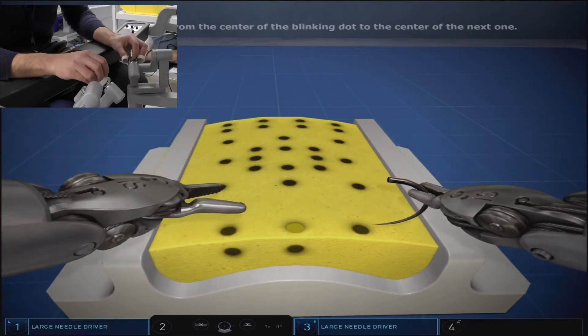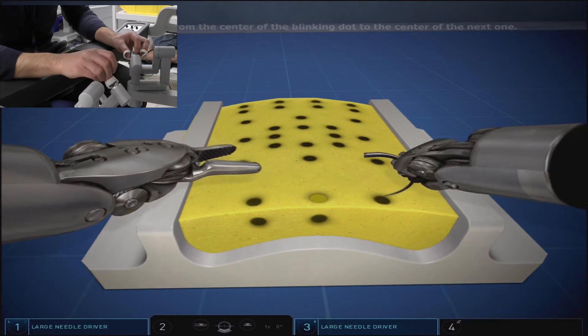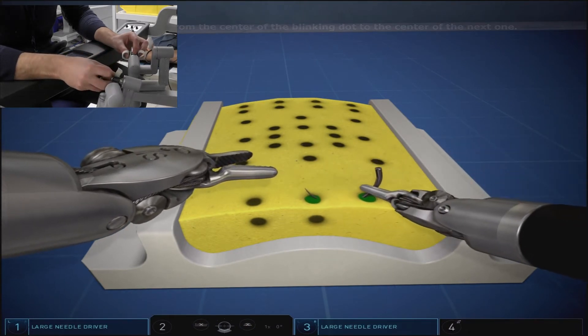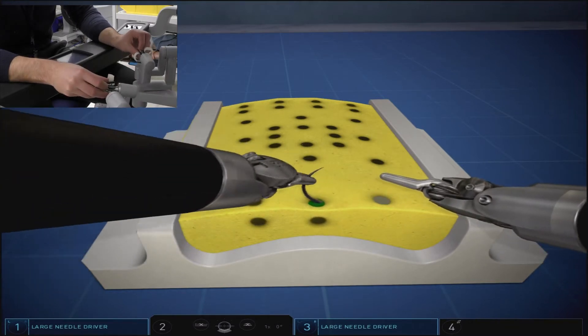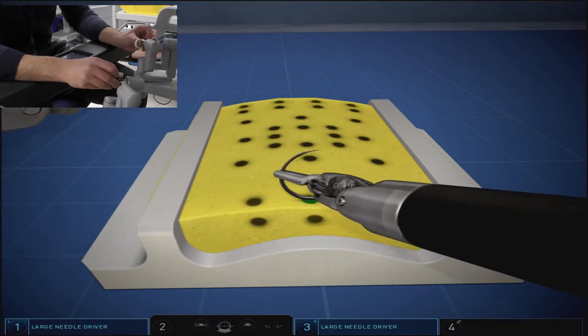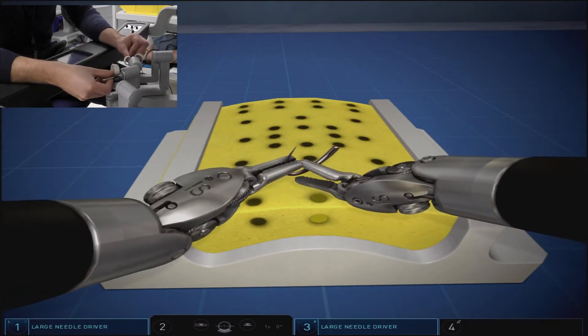You'll be required to connect the dots through your suturing, first starting with the dot farthest screen right. In order to stay oriented, you will need to note that the entry site is the blinking dot, and the exit site will be the open, non-blinking dot.